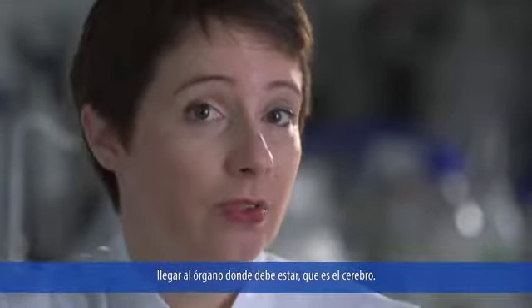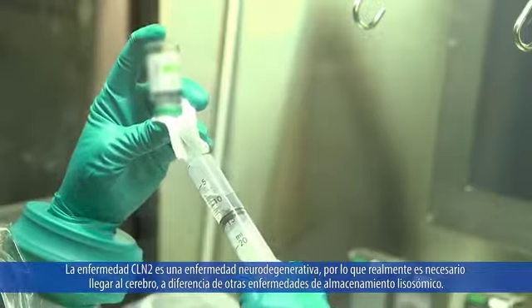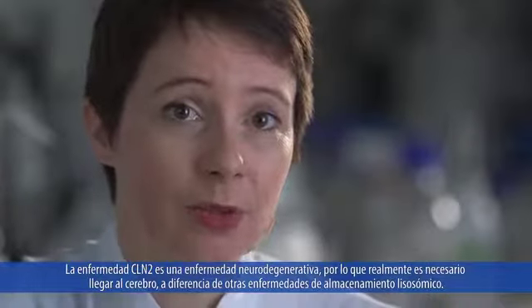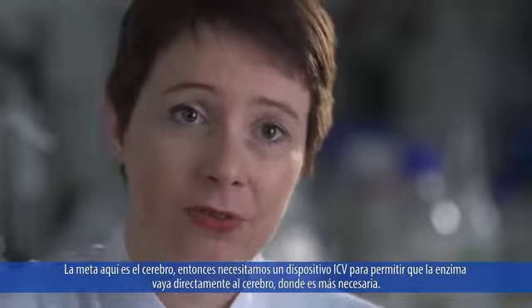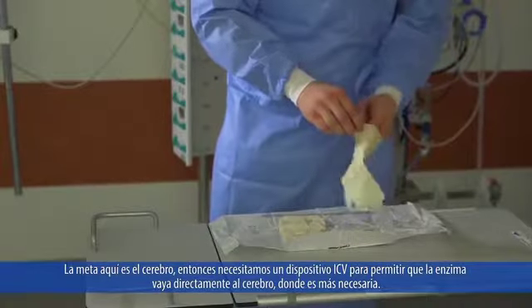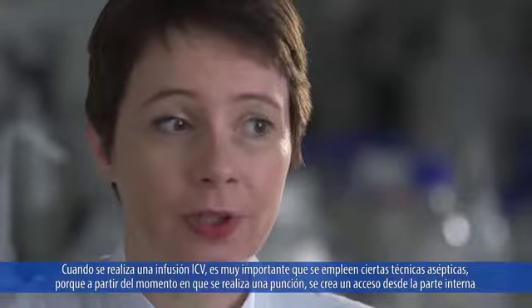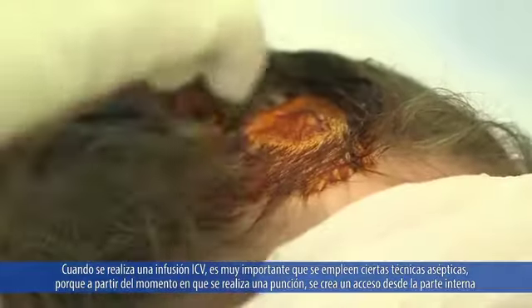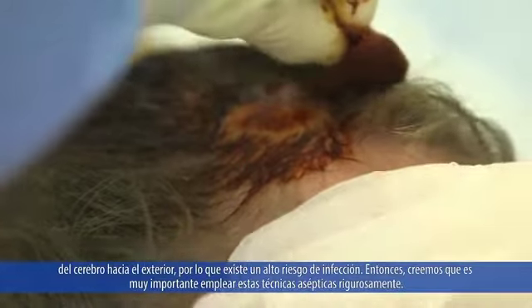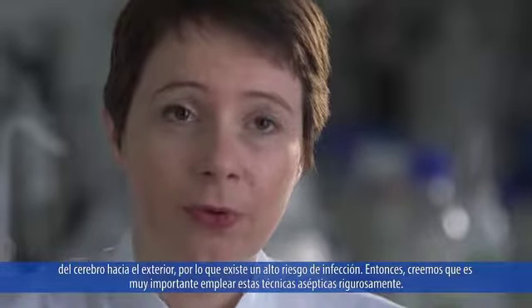CLN2 disease is a neurodegenerative disease, so we really need to target the brain, different from some other lysosomal storage diseases. So here really the target is the brain, so we need such an ICV device to allow the enzyme to go directly to the brain where it's most needed. When you perform ICV infusion, it's very important to follow certain aseptic techniques, because the moment you puncture the device, you provide access from the inner side of the brain to the outer side. So there's a high risk of infection, and we feel it's very important to work strictly with aseptic techniques.